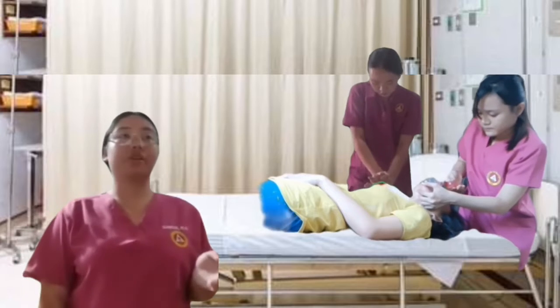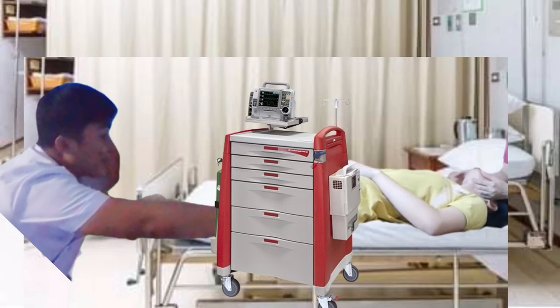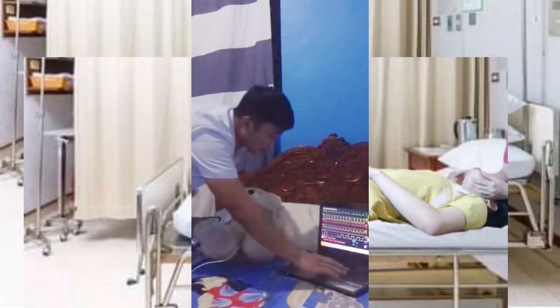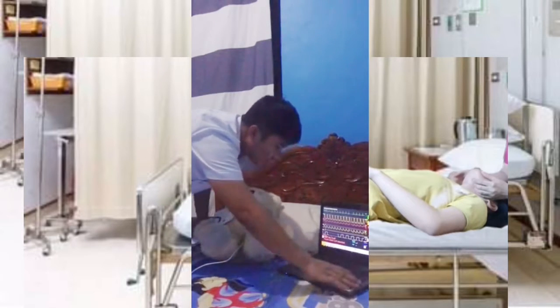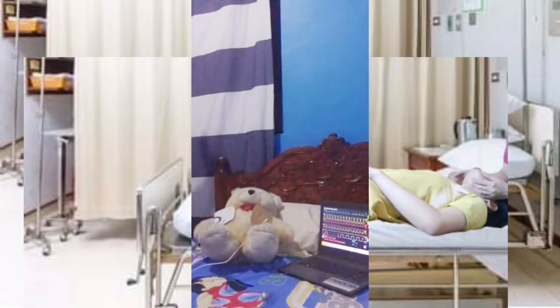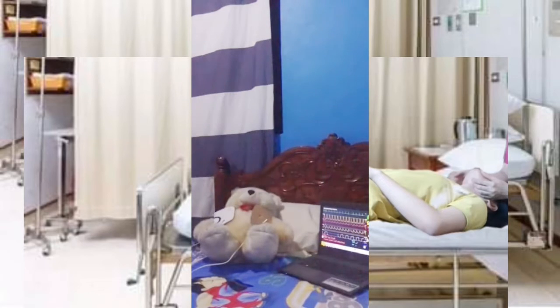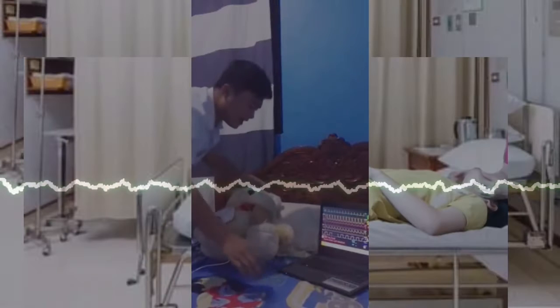Prepare the defibrillator, starting at 150 joules. Charge 150 joules. Stand clear, everyone clear. Start shock. Shock given. Start CPR.